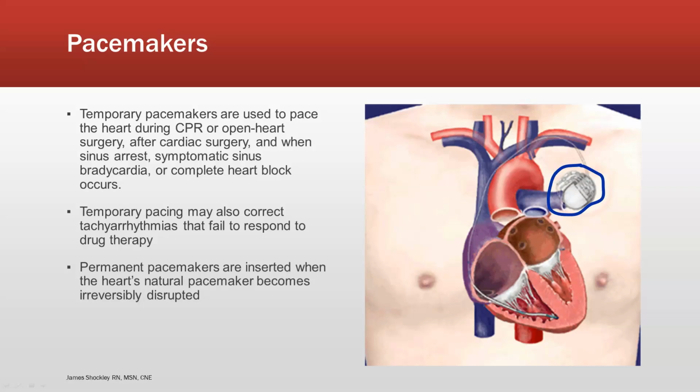And then we see the wire that is being fed through the superior vena cava into the right atrium and finally into the ventricle. And that's what's going to deliver the shock, deliver that oomph that your heart needs to maintain a heart rate. So for instance, if this client were 100% ventricular paced, it means you would see a pacer spike before every QRS complex. And I'll give you an example of what all those look like, whether it's AV paced, V paced, A paced.